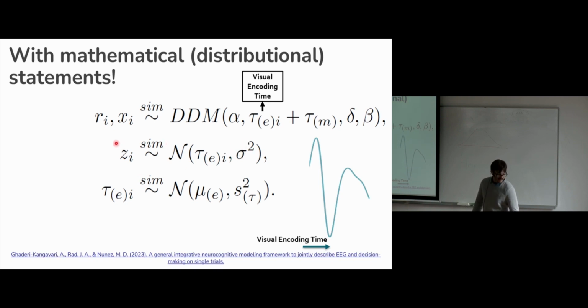So the total, if I measure the total variance of my single trial EEG, like I just take my var in Python or MATLAB, after I estimate my single trial latencies, then the sum of S squared plus sigma squared will always equal that variance. So one key feature now is I can actually find out what percentage of variance is related to my cognition of interest in this kind of model.